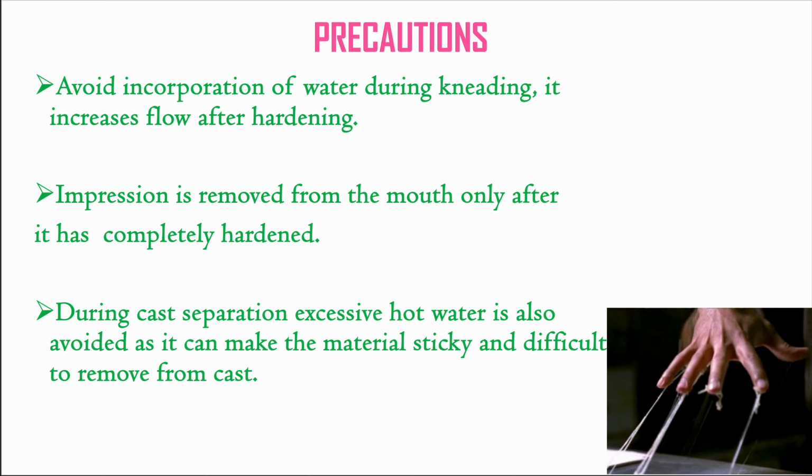Avoid incorporation of water during kneading. It increases the flow after hardening. Impression is removed from the mouth only after it has completely hardened. During cast separation, excessive hot water is also avoided as it can make the material sticky and difficult to remove. Also, the sticky material can stick onto the cast and it might be difficult to remove it entirely even if you place it in mild hot water.